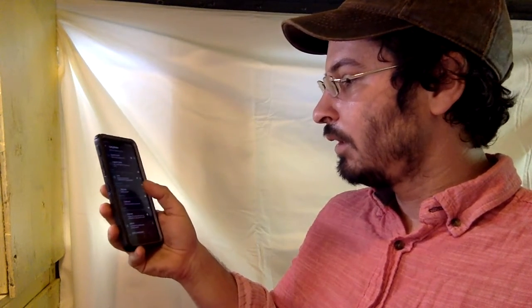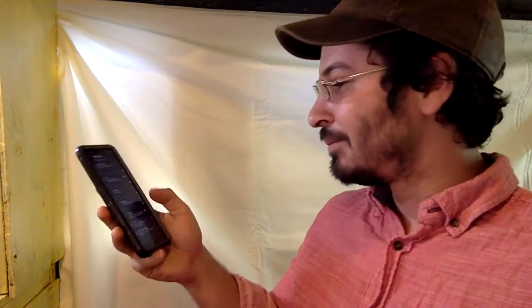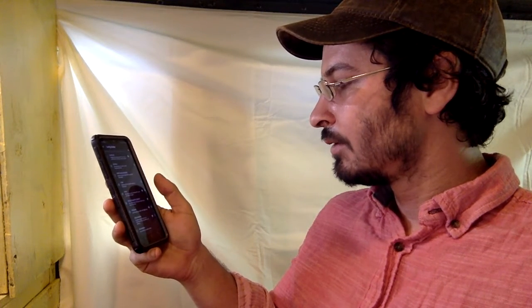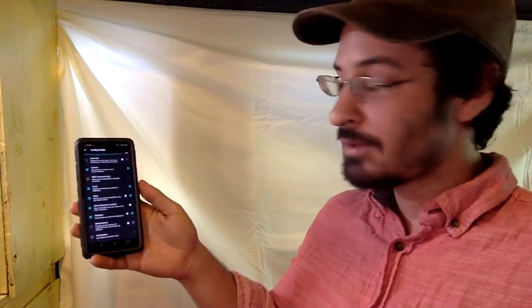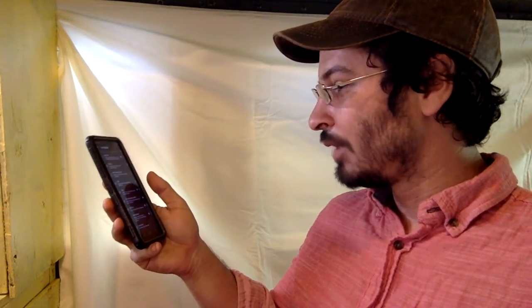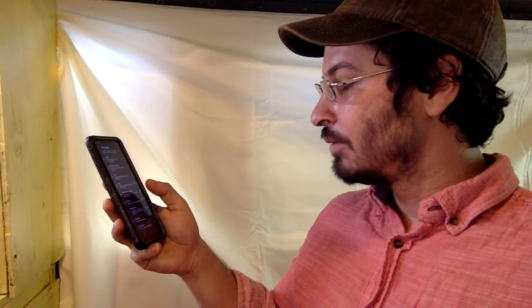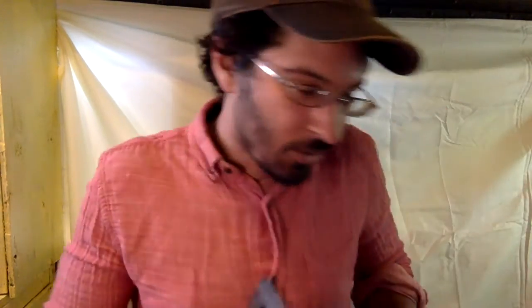Loop, turn the loop on. Constraints, you've got constraints from the objectives. Treatment plugins. Remote control: Android APS using SMS, so if you want to communicate with text message for your son or daughter who's looping, you can check to use Android Wear. Where's my watch? I feel like I'll grab my watch.